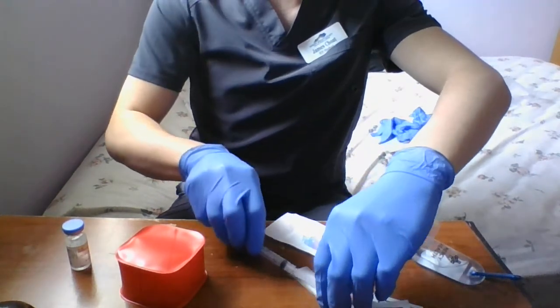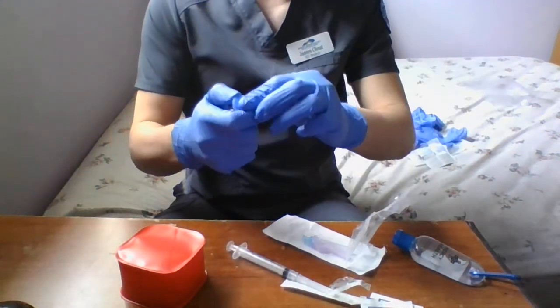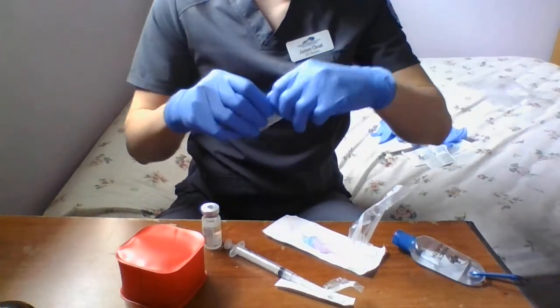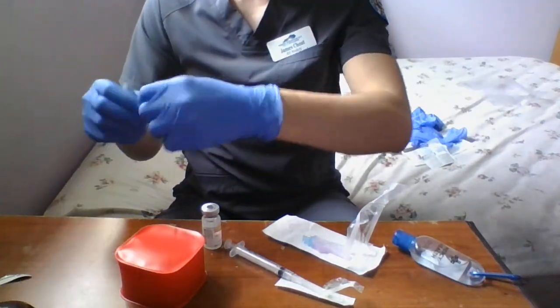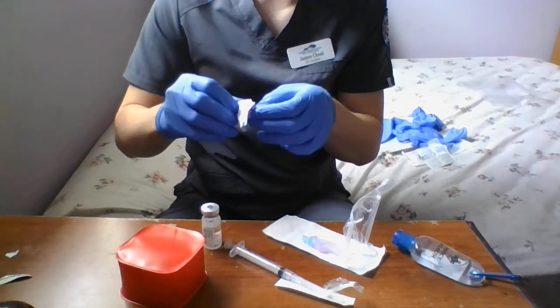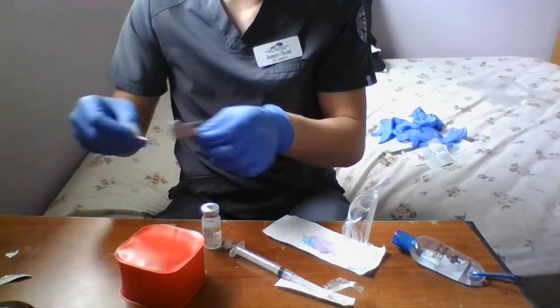It's on there good. I'm going to take that plastic off just 1 second. Break the plastic seal for that. I'm going to rub the top of it with alcohol. Just let it air dry. You don't want to blow on it because that would defeat the whole purpose of cleaning it.